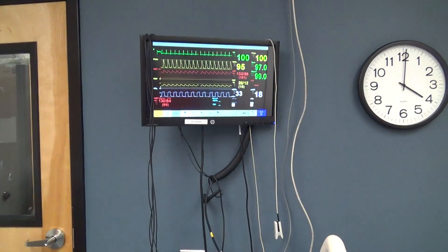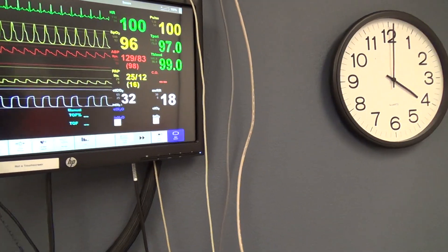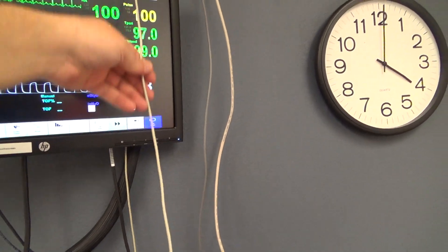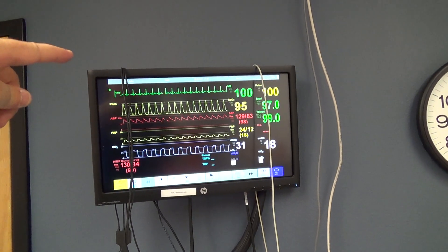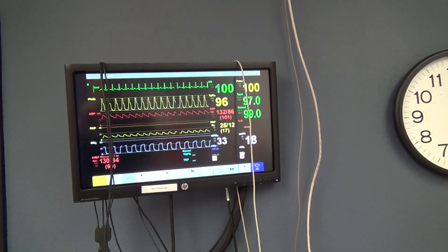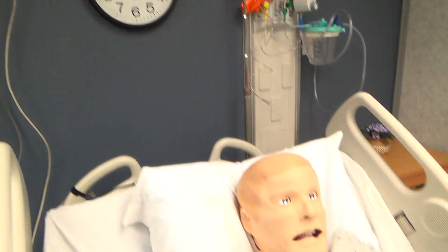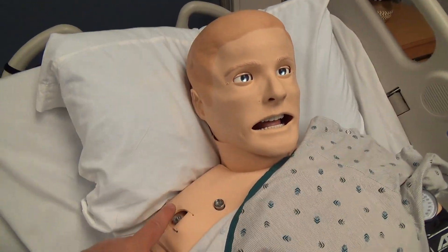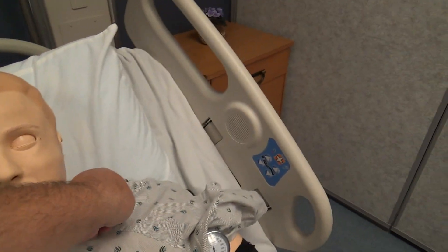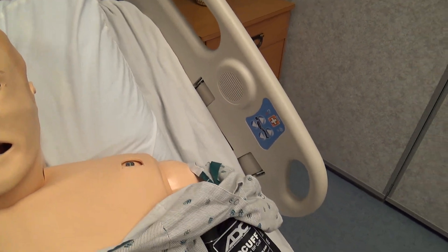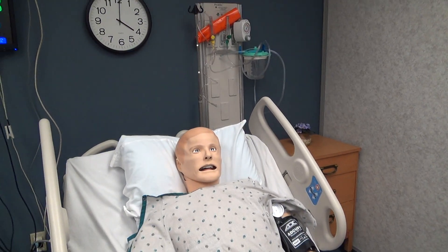Also with the patient is the patient monitor. There is a three-lead heart monitoring and also a pulse oximeter. When you place these on the patient, your three-lead ECG and pulse oximetry will show up on screen — until that point they will not show up. The patient has a space here — sometimes a flap is over it — where you hook up your three-lead, on that shoulder and also down on the abdominal area. When you hook it up to your patient it will come up on your screen.